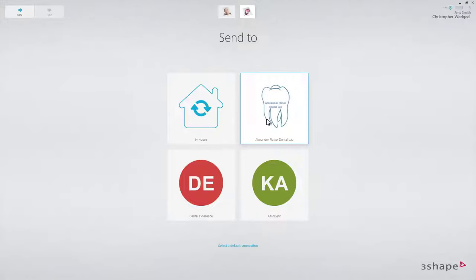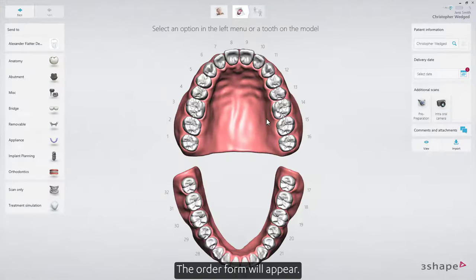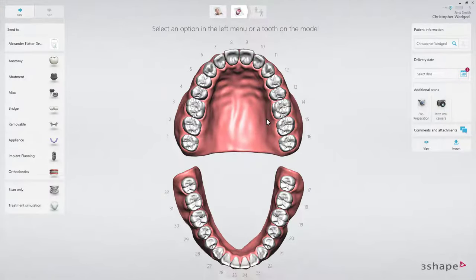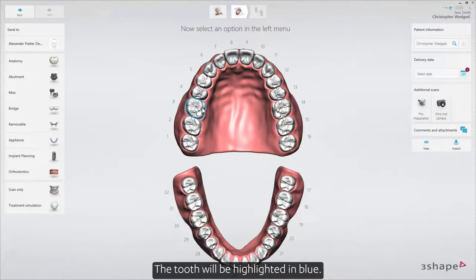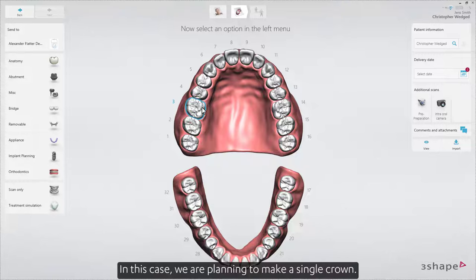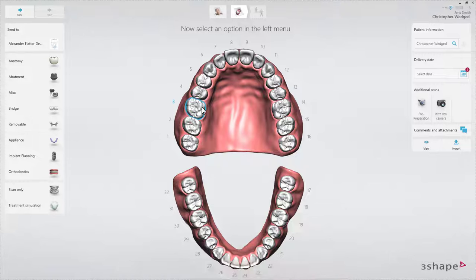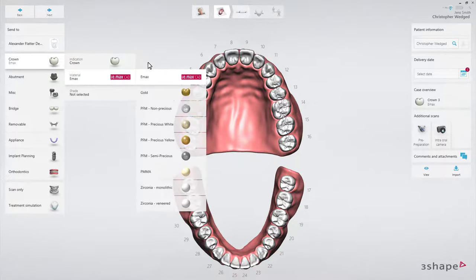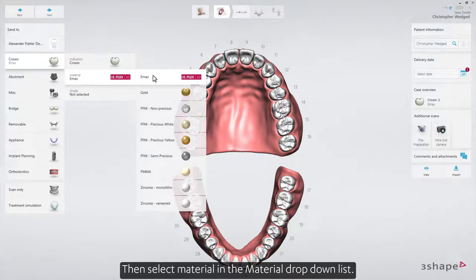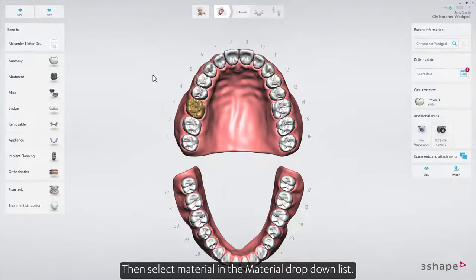Select Lab. The order form will appear. Select the tooth that needs to be restored — the tooth will be highlighted in blue. We are planning to make a single crown. Click on the Anatomy drop-down list to select Crown, then select Material in the Material drop-down list.